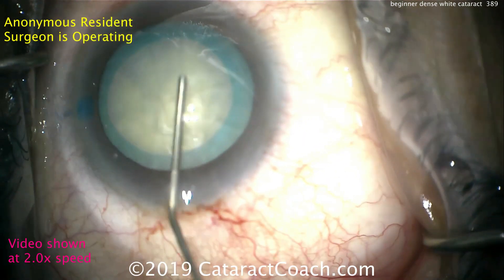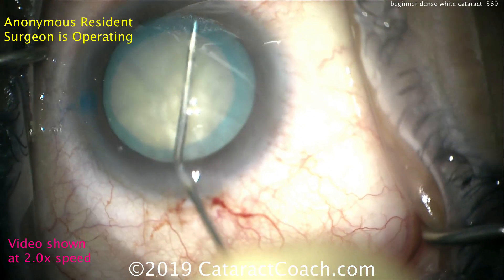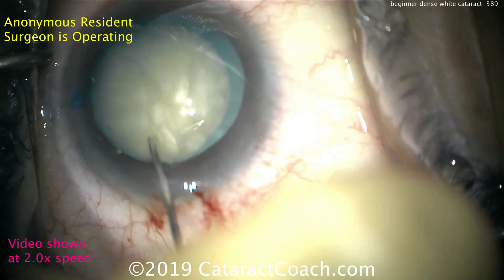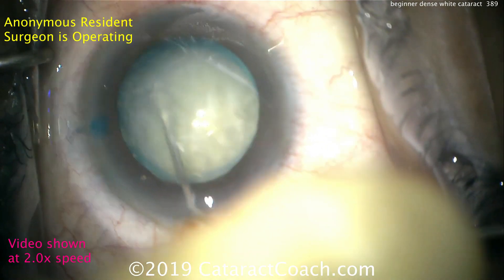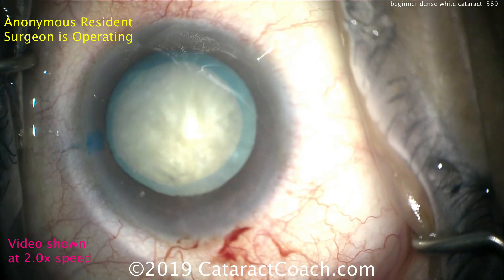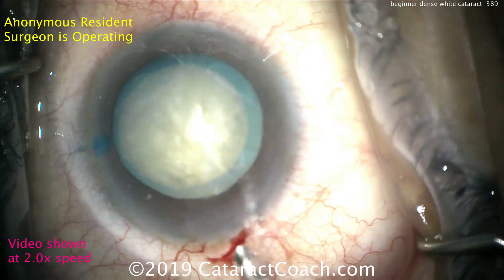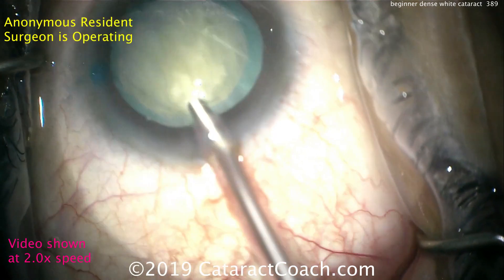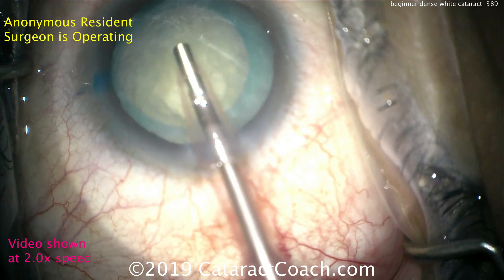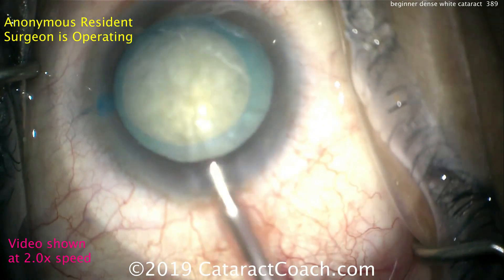Looks good — tapping the center of the nucleus. It may rotate without any hydrodissection because these white cataracts tend to have a soft or liquefied cortex, and it does rotate a little bit. Let's see what phaco technique we'll be doing. Here's the phaco probe — looks like a 2.4 sleeve, maybe 2.2 or 2.4. That looks good, phaco probe in the eye.